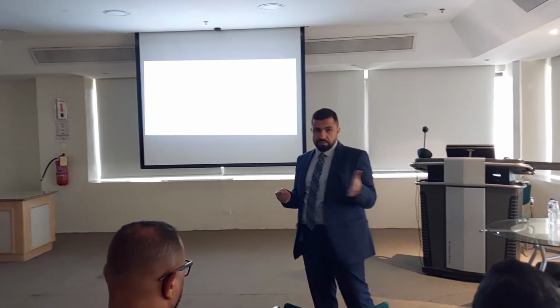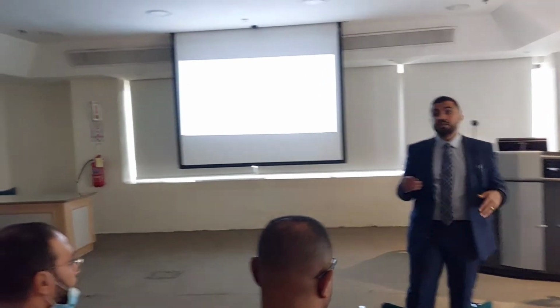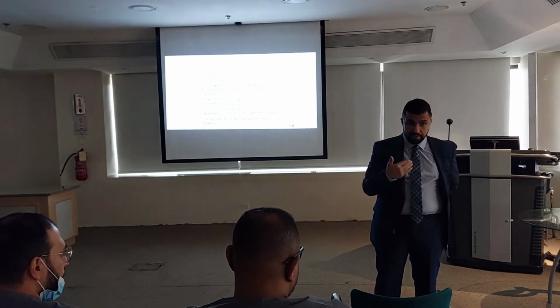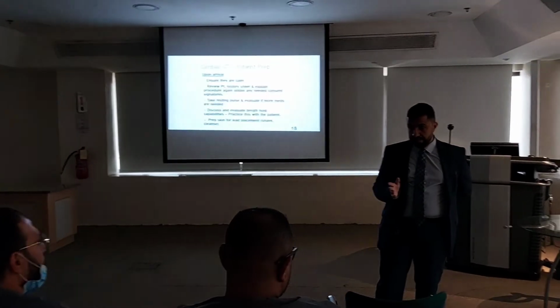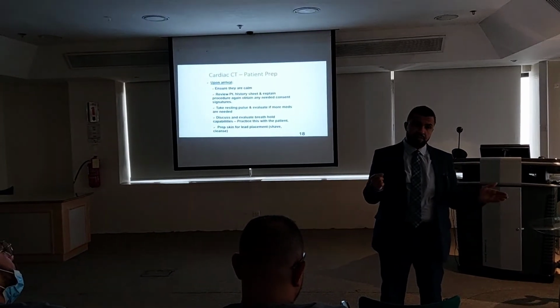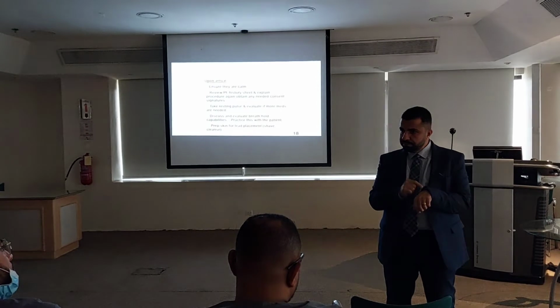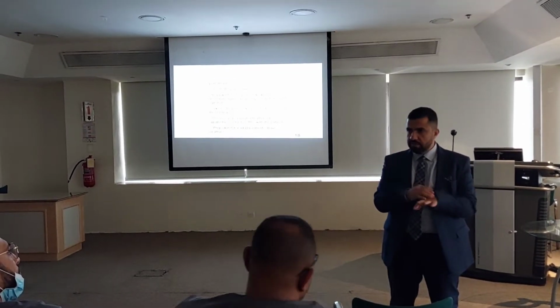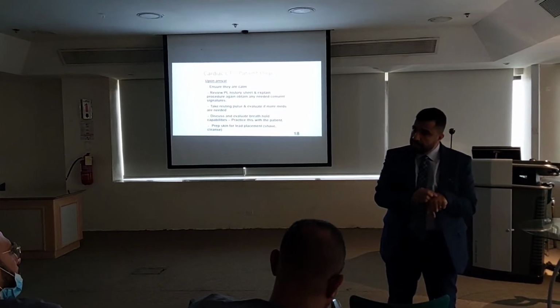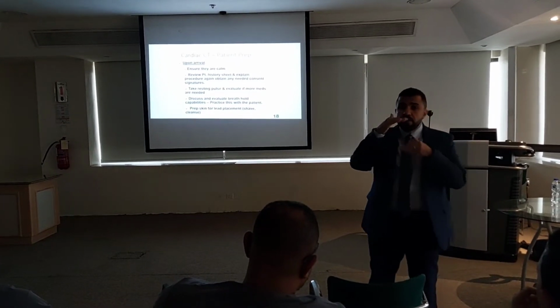If you have the supply, it's very good to get it. Otherwise, you need to use alcohol, but you need to wait afterward. This is skin preparation. I will apply a very small amount, less than 1 cc, less than half a cc in every location, and dry it. Keep cleaning with dry gauze till it's gone. This gives very good connectivity.